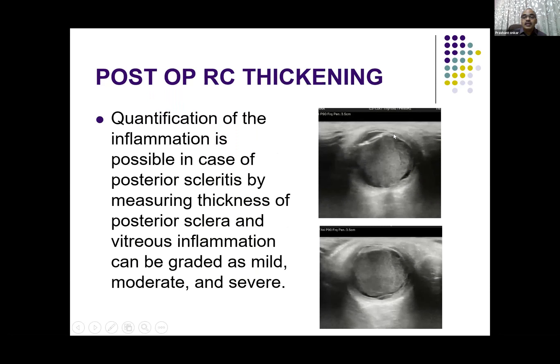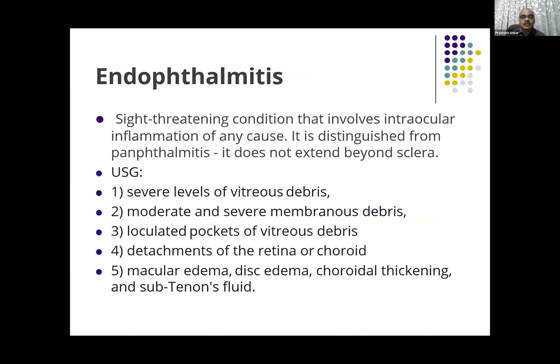Another example — the vitreous is full with dense internal echoes, and the coats are quite thickened. This can be labeled as vitreous or posterior chamber inflammation. The quantification of inflammation is possible — you can see how much exudates are there, where the membranes are, and how the coats are increased in size. This is also useful for follow-up.